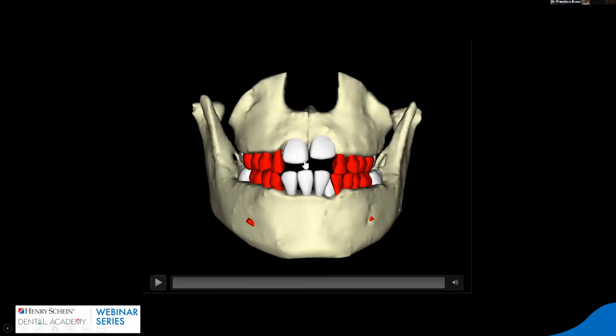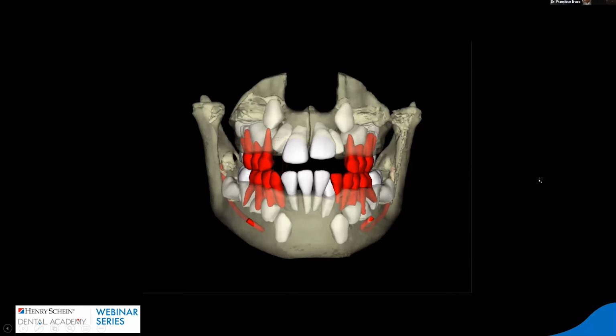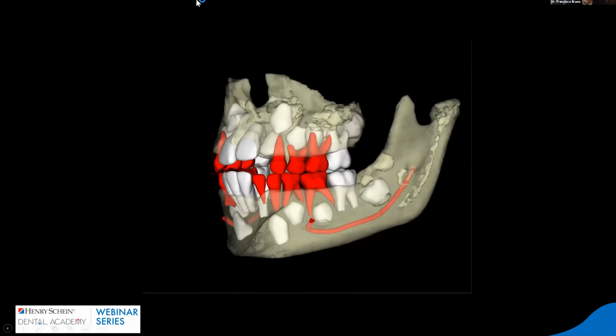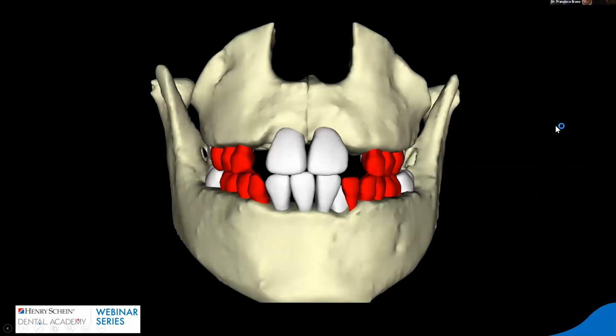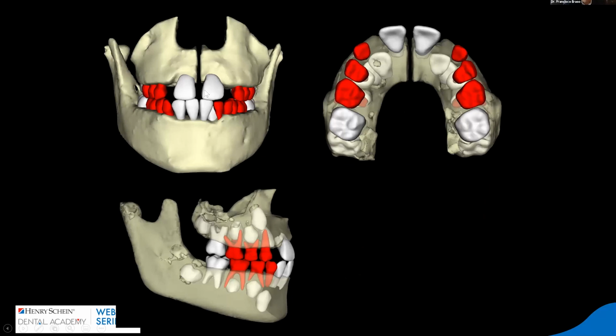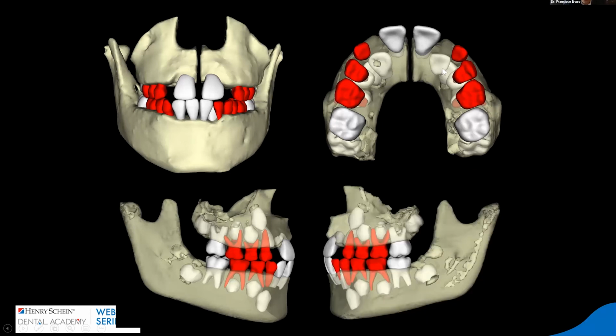I think somewhere here it was when I move the teeth and create the expansion, I create some space. I think I have enough time for you to ask me some questions and maybe spend time coaching. This is the expansion. So then we do the expansion, create the space for the lateral incisors and create the space for all of the other incisors to come down.